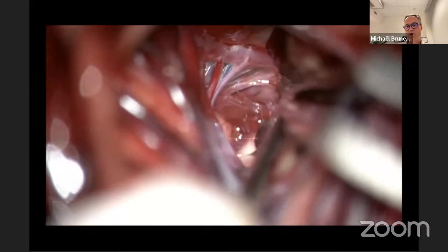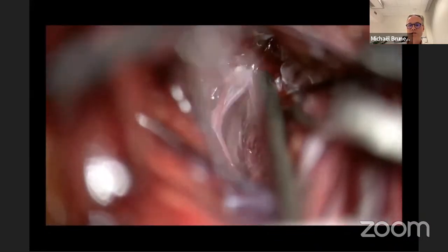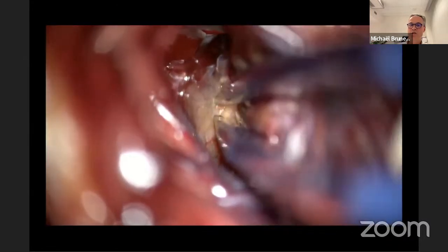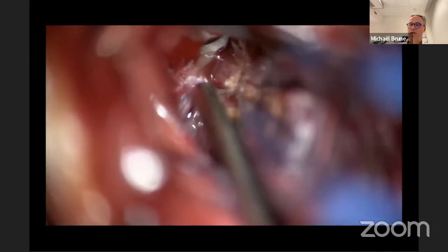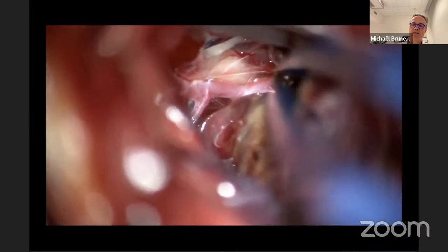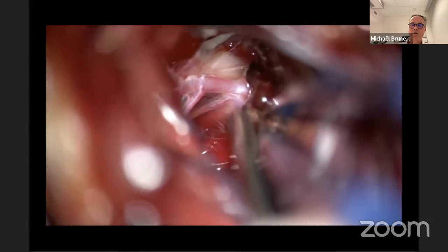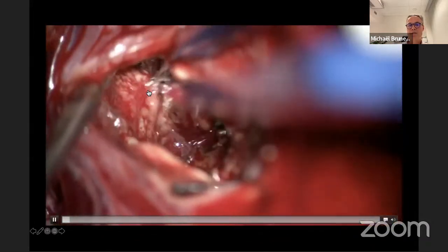You can open the cavernoma in order to release the mass effect. At some point, coagulate a little the cavernoma to retract the lesion. This is made right now. It's like a meningioma, a very massive cavernoma. Retraction of the lesion. You perfectly see now the P1 segment.